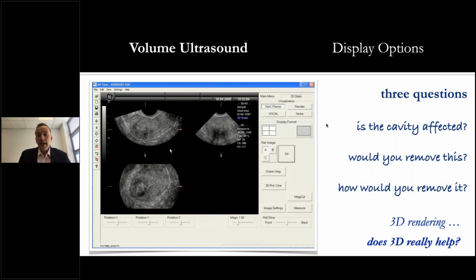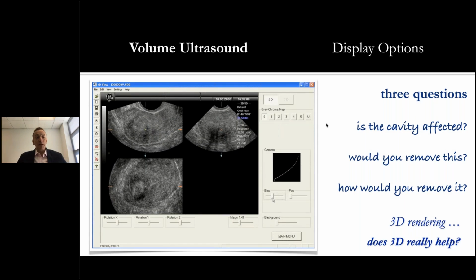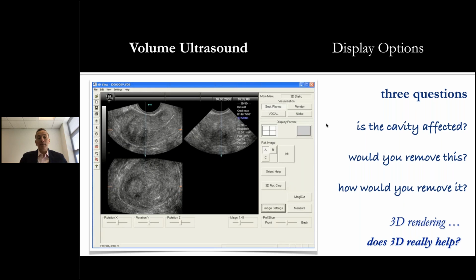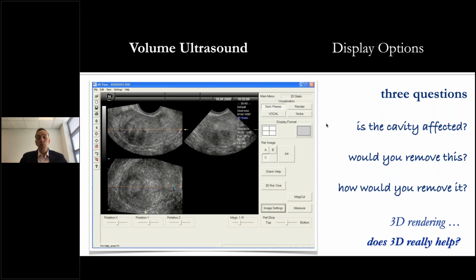This is again my World Cup fibroid. Okay, so you'll see why it's the World Cup in a minute. So look at this basic picture, really unclear. The images blur into one. There's probably some degree of adenomyosis here. So you cannot be clear in that picture whether there's a fibroid, if there's adenomyosis. It looks like there's a fibroid, but it's a poor quality image.